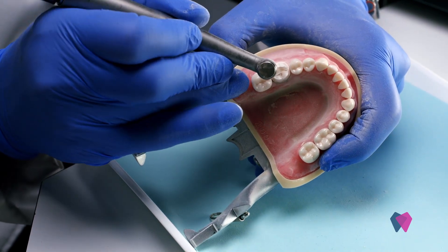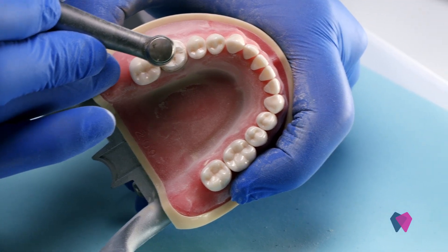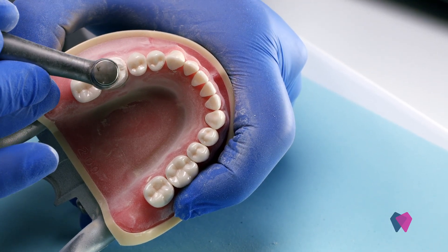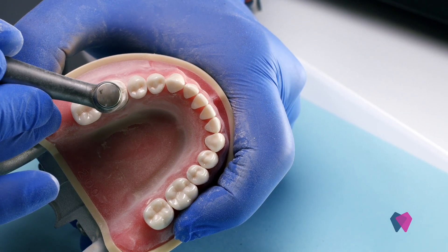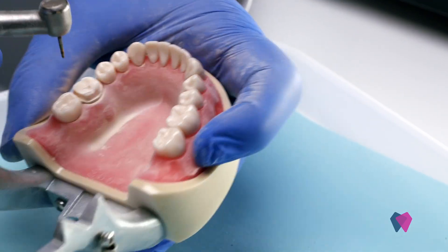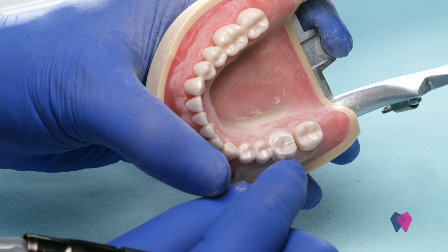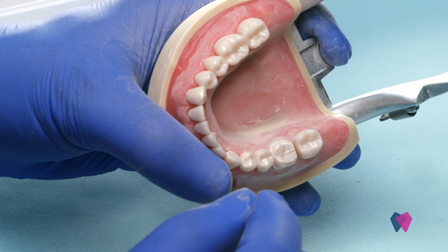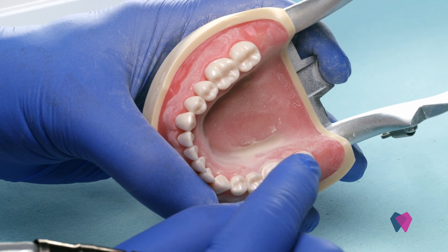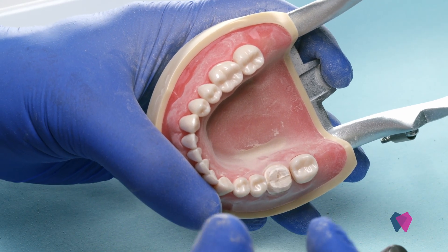Still got to get a little bit more space here on the distal. So when we look at this preparation, notice you can see all of the little grooves in here. Do you want to remove those grooves and get a polished surface to your crown prep? I don't think so. I like leaving it nice and rough on the occlusal surface and the sides so that the cement is able to penetrate into these areas and give us a little bit more cement retention.